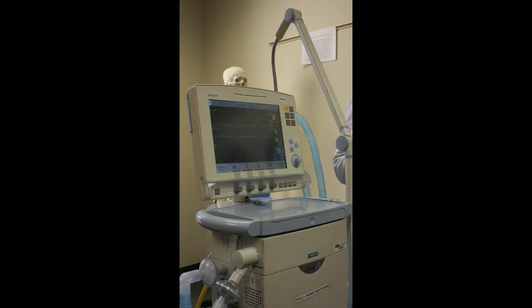Maria, if we're in ACVC right now, can we have pressure support? No. Why not? Because it's assisting. What is pressure support for? The pressure that's being given to the lungs. But what kind of breath? Spontaneous. Pressure support will only be on a spontaneous breath.